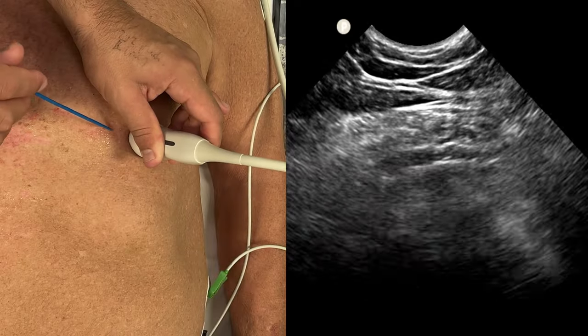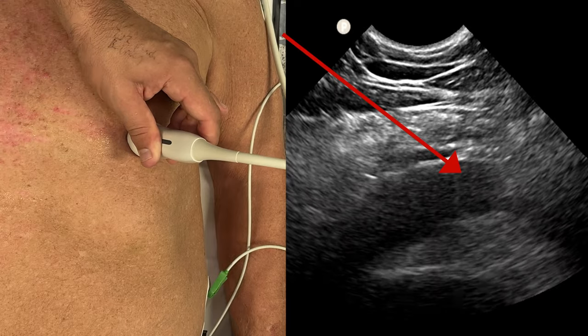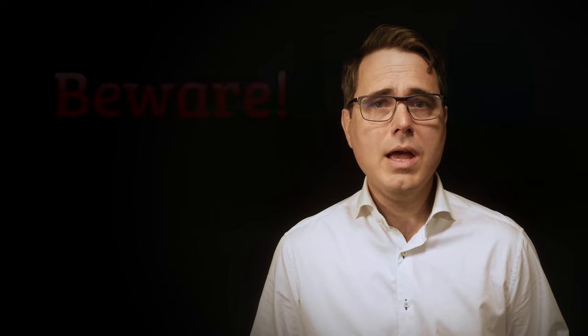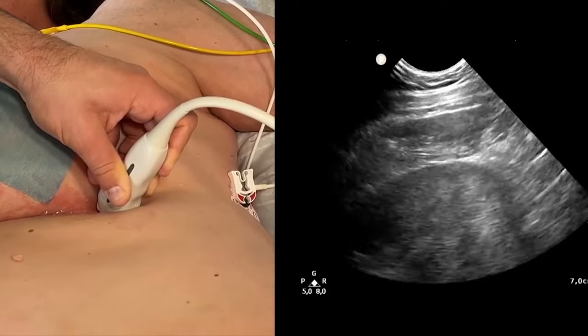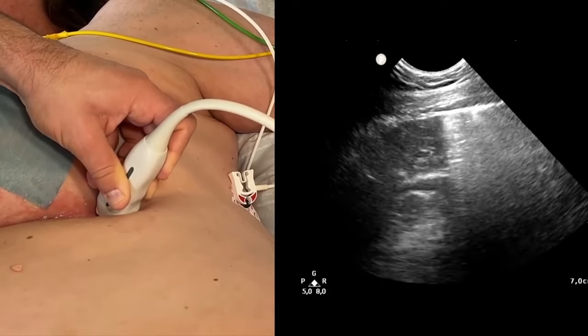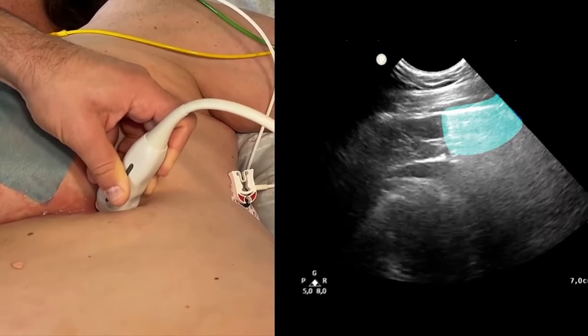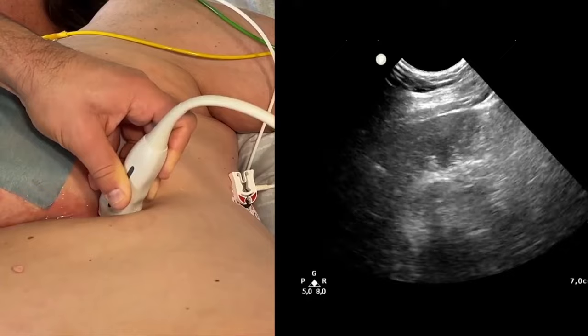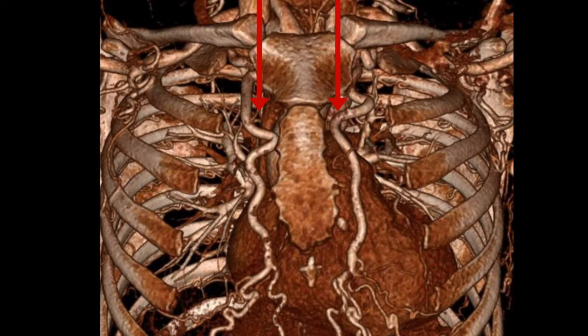Back to our patient, with the same image orientation. The approach to the pericardial fluid is from ventral to dorsal. There are some risks that need to be considered with the approaches presented here. The lung is nearby with a lateral approach. In this parasternal left ventricle-adjacent approach, the lung can be seen entering the ultrasound screen from the right as the patient is breathing. A lung puncture is avoided with ultrasound guidance, and keep in mind that a pigtail placed through moving tissue will cause quite a bit of pain. Should the puncture site be very close to the sternum, this is close to the internal mammary arteries, which you can see here on this CT scan.